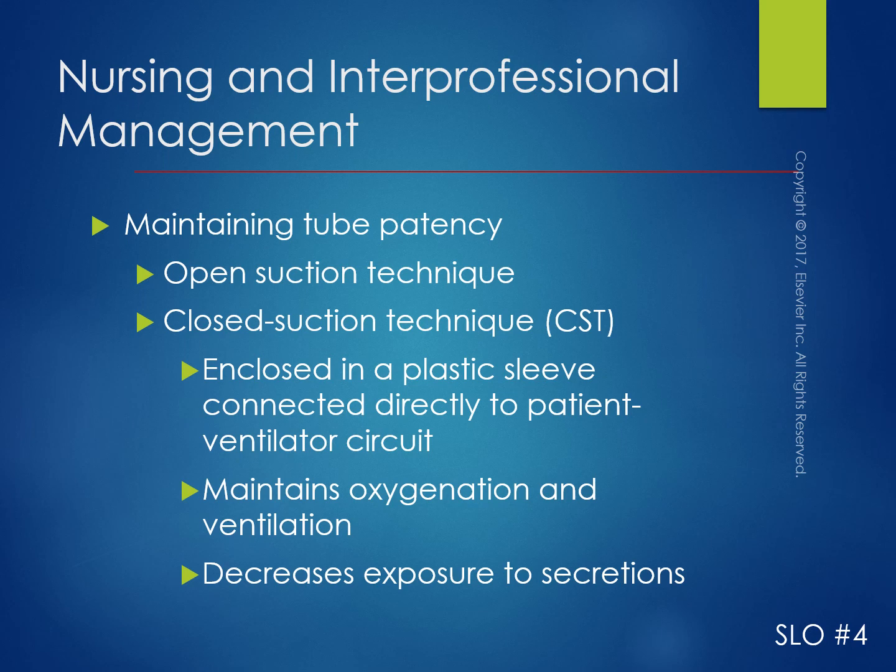So, open suction technique. This is what you were taught in the second semester, and this is for a tracheostomy. This is a sterile procedure. You use your sterile gloves and maintain sterility of the catheter. The closed suction technique is really nice, and I'm going to do a little video where I show you Fred, my mannequin head, that has a closed suction catheter hooked up.